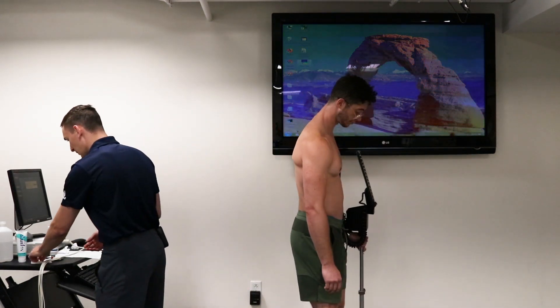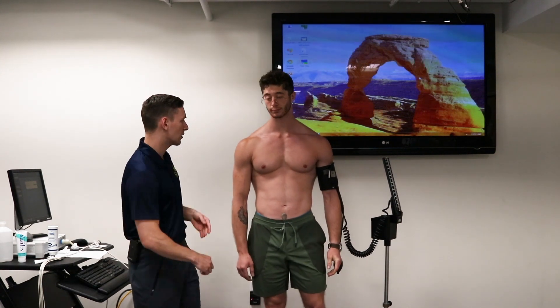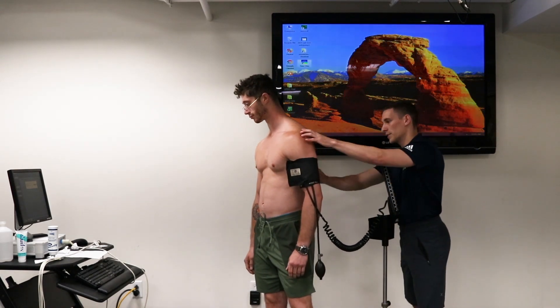To finish off, we're going to wipe it down with some clean gauze, making sure all that new prep is off and all that alcohol is off. The skin should be nice and red.